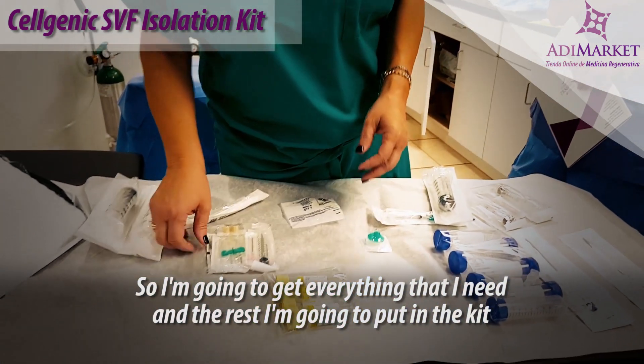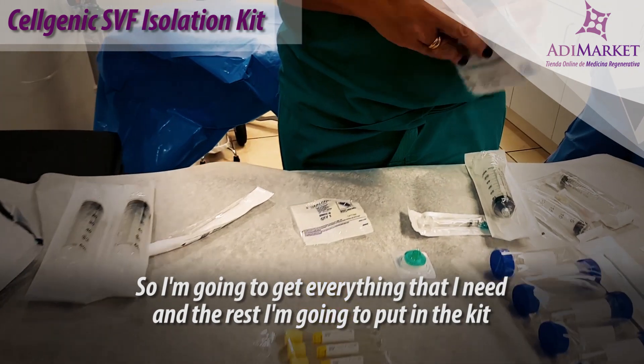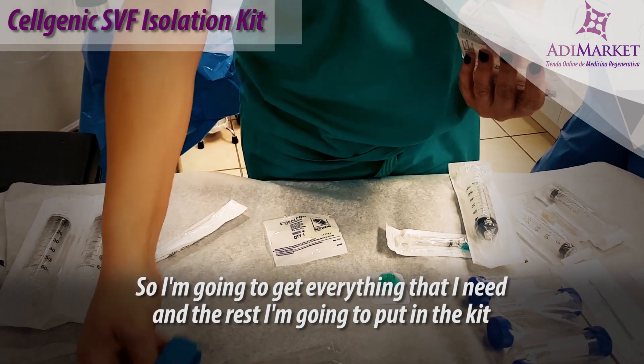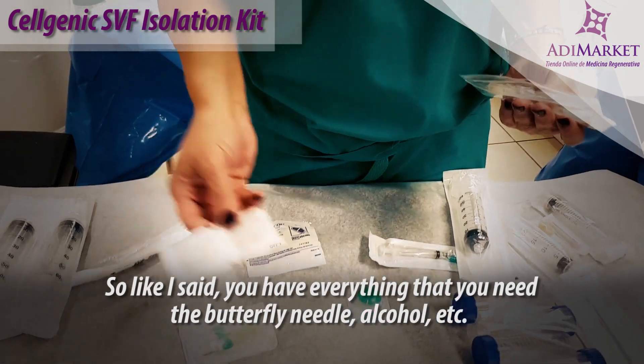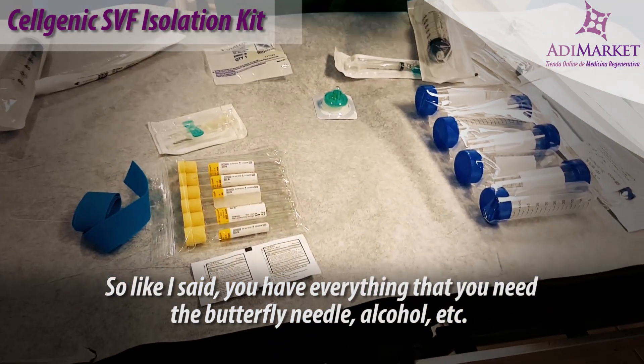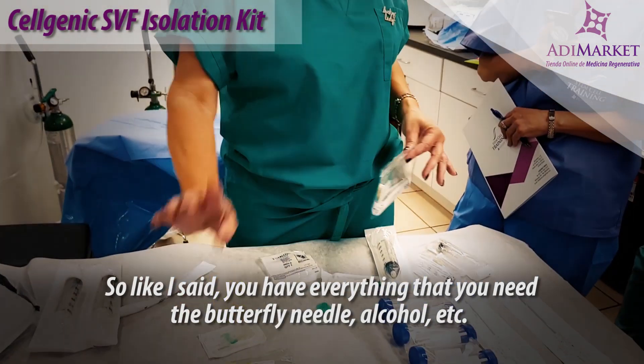I'm going to get everything that I need and put the rest back in the kit. You have everything you need: the butterfly needle, alcohol, and the water.